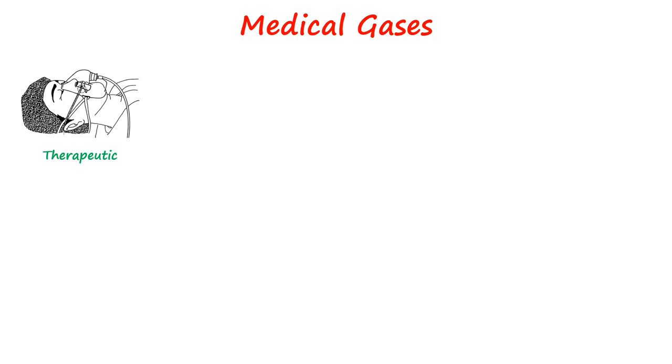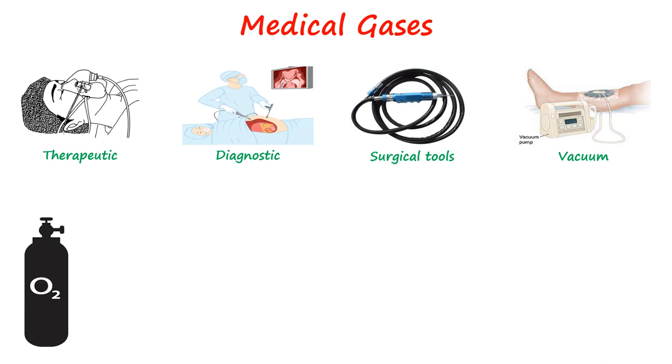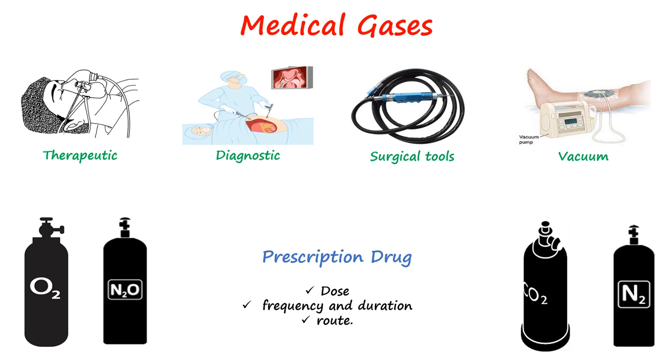Medical gases are any gas or mixture of gas intended to be administered to patients for therapeutic, diagnostic, or surgical tool application. In addition, waste anesthesia gas disposal and medical vacuum are also considered part of the medical gas system. Commonly used medical gases are oxygen, compressed medical air, nitrous oxide, carbon dioxide, and nitrogen. Medical gases are considered prescription drugs and should be prescribed appropriately with dose, frequency, duration, and route.